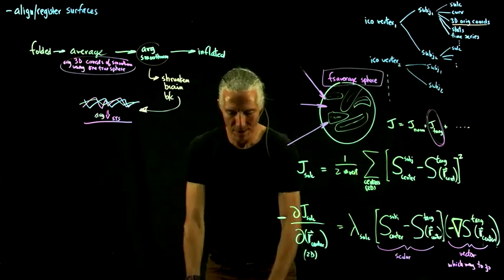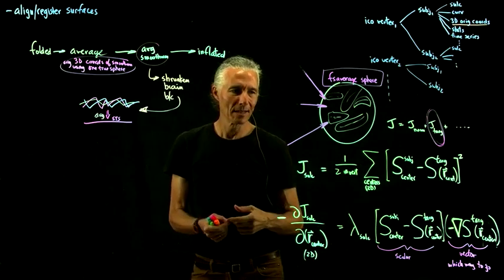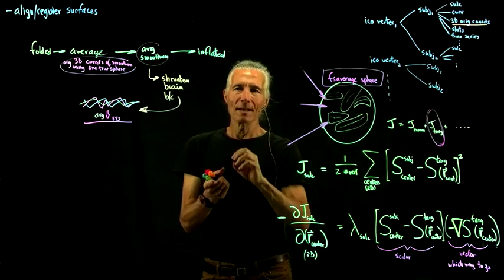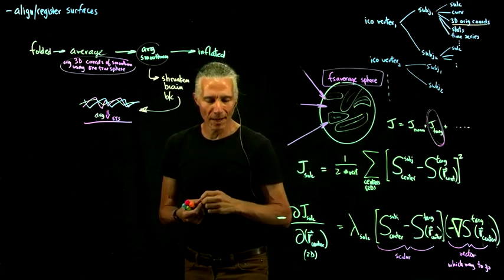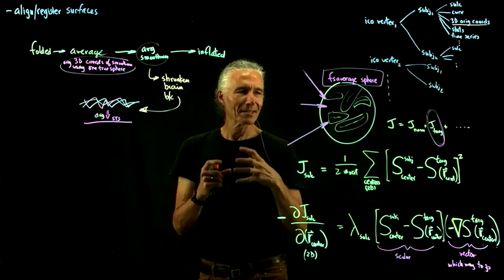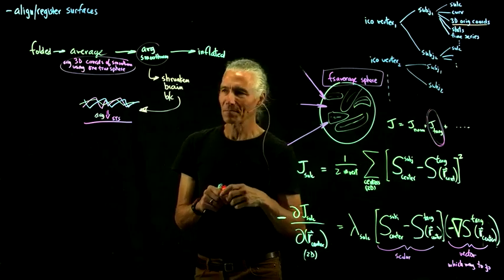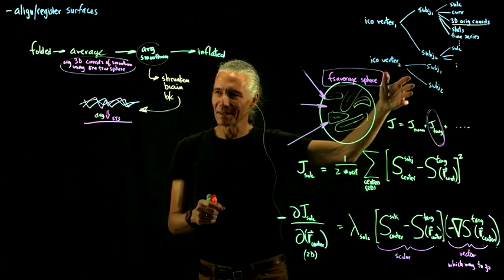What they want is to just use their regular 3D statistics packages, and then after they're done doing everything in 3D, sample it onto a surface for display. That way you can make a nice picture without going through the pain of dealing with these lists of vertices.